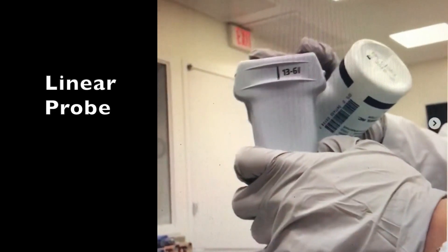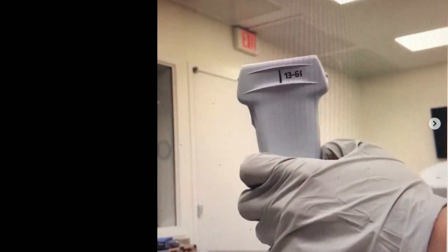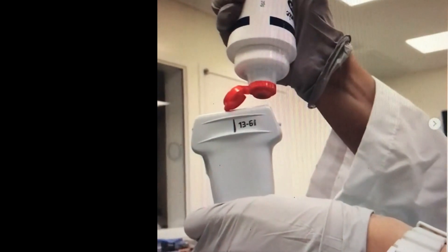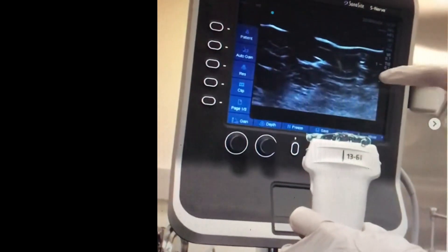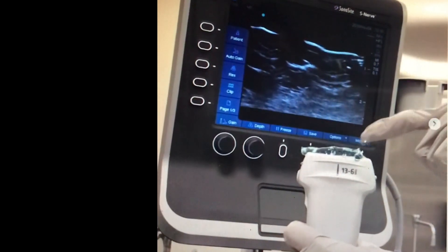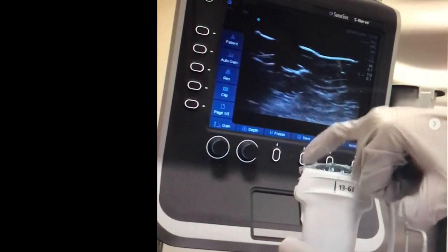This is the probe we'll be using to do an interscalene block and for a lot of peripheral nerve blocks. First, apply some gel. To check which side is left and which side is right, look at the ultrasound machine — push your finger down on the probe and you'll see an indentation on the right side. That's how you confirm orientation. That's the first part of checking the probe.